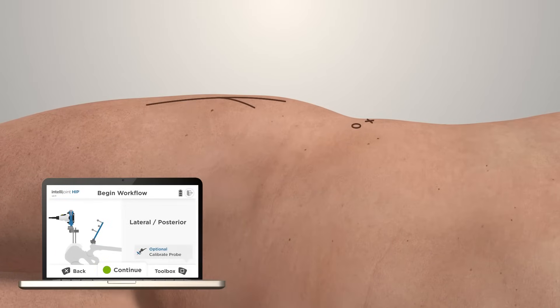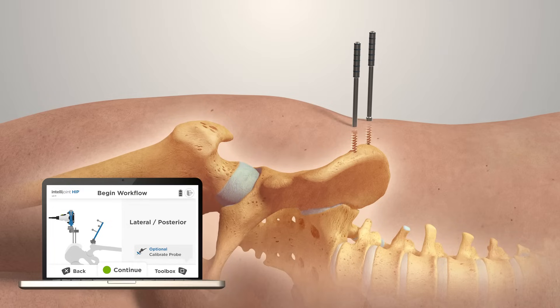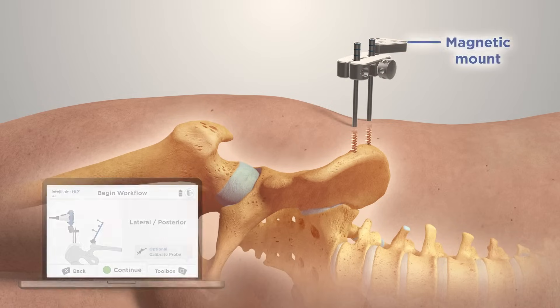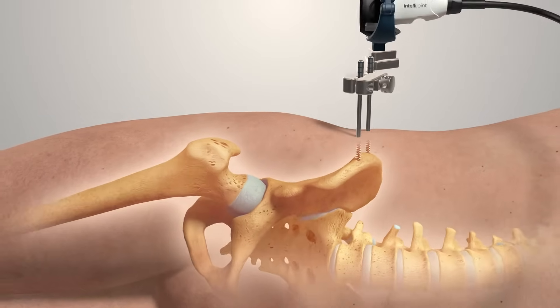IntelliJoint HIP requires no significant additional incisions. Make two small stab incisions on the iliac crest. Insert self-tapping screws into the pelvis, and slide the pelvic platform onto the pelvic screws. A magnetic mount is used to attach the camera to the pelvic platform.